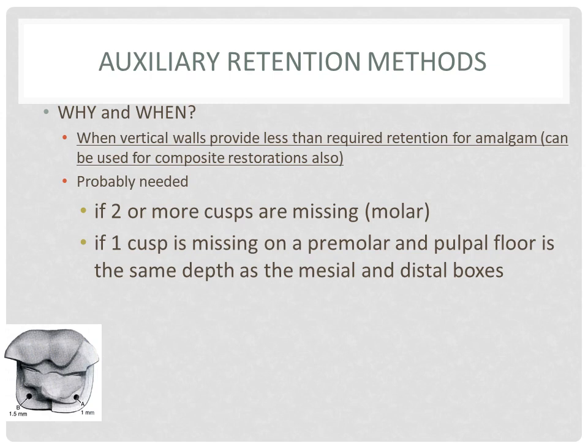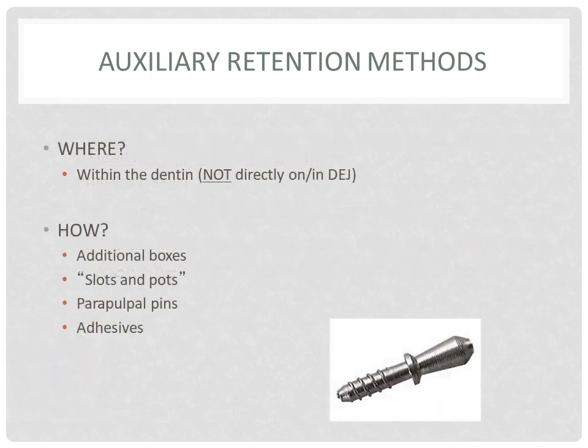To use a pin, 3.5 or 4 mm of preparation depth must be present. 2 mm for the pin, and 1.5 or 2 mm for the amalgam, depending on whether it is a functional or a non-functional cusp.